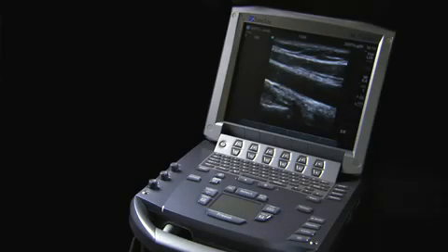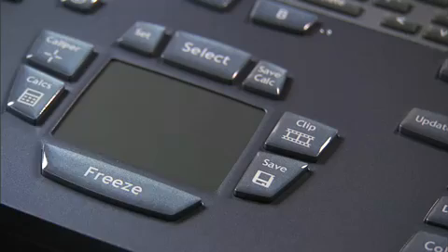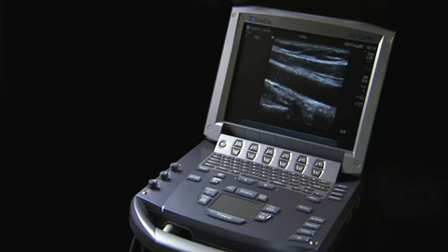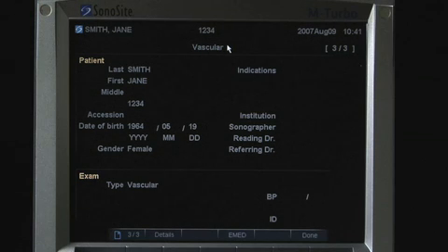To save a frozen image, select the Save button. Images of the screen display or patient reports can be saved to print or export.